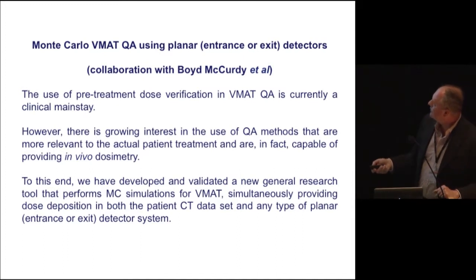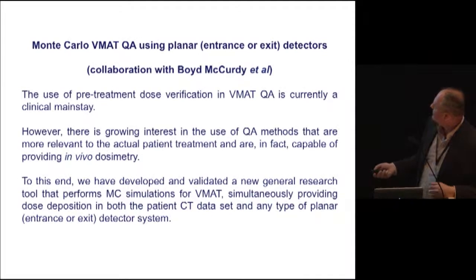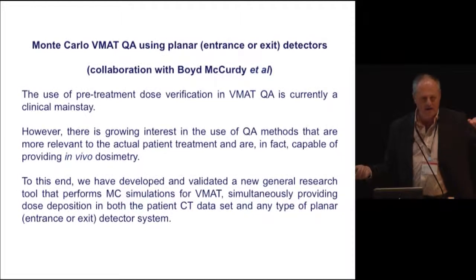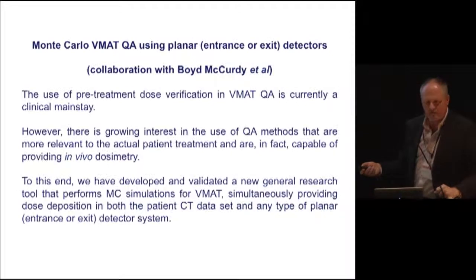In collaboration with Boyd McCurdy in Manitoba, we have developed and validated a general research tool that performs Monte Carlo simulations for VMAT, simultaneously providing dose deposition in both the patient CT and any type of planar entrance or exit detector system. They had the COMPASS detector that can be attached to the gantry, and it's an independent beam check.